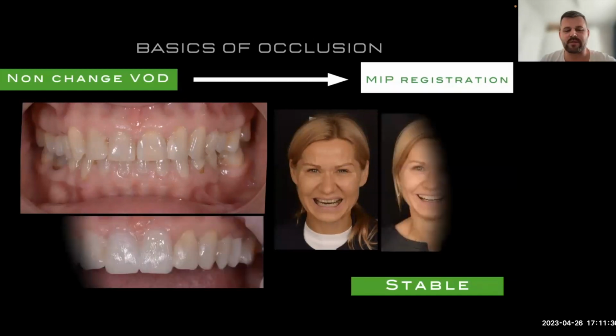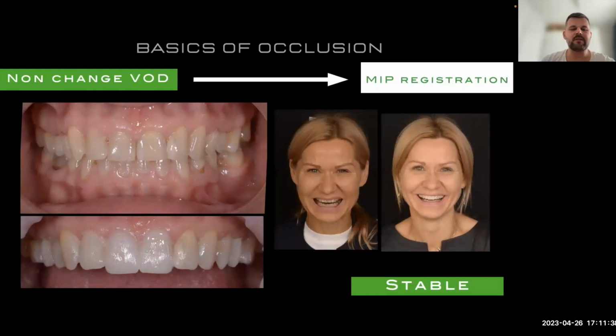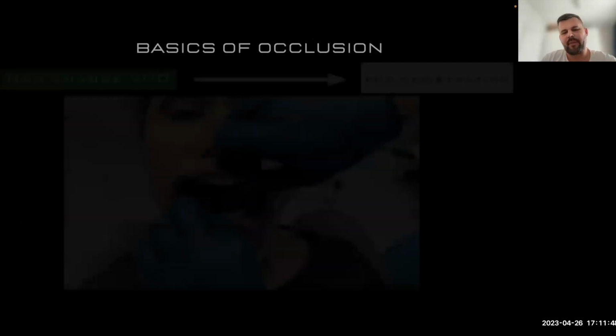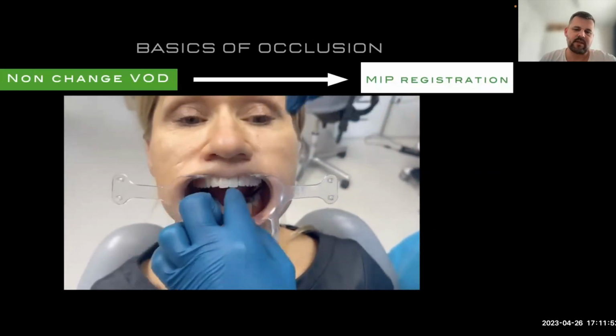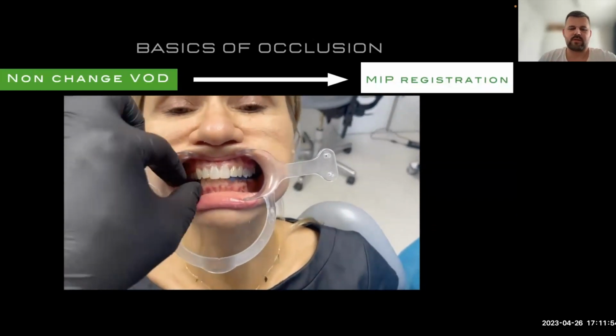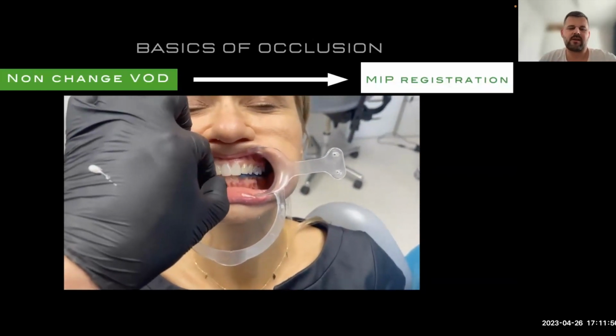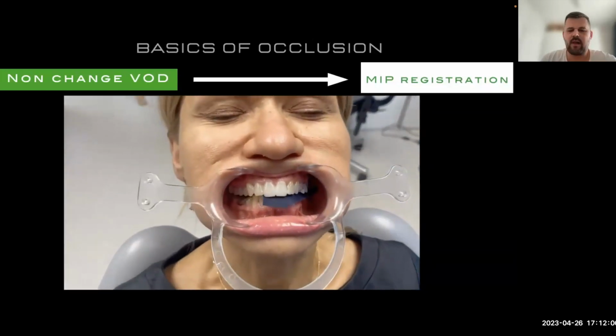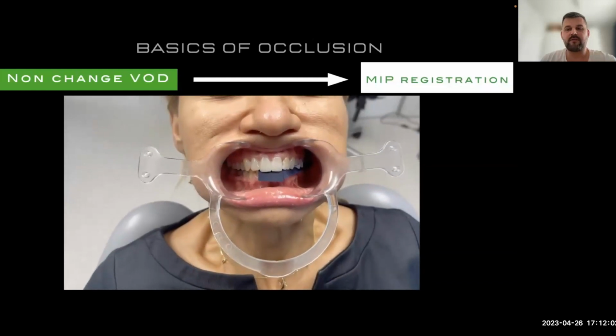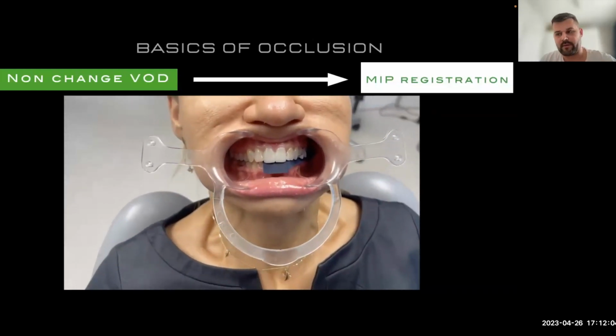So we prepare, of course, a mock-up. And the first thing I do to check whether it will work in the mouth or not is to check the function. So I gave the patient articulating paper and just told her, do what you want. Just try to bite, try to move, touch where you want, go forward, go backward, lateral. And like you see on this video, the patient feels right now that something is broken.